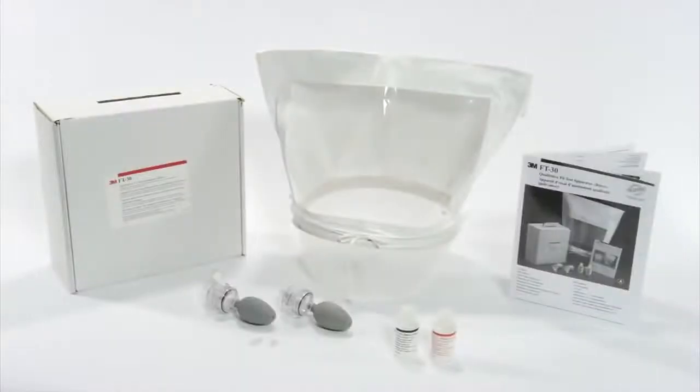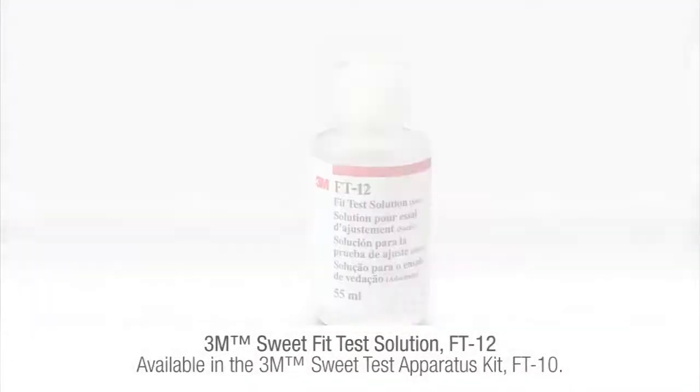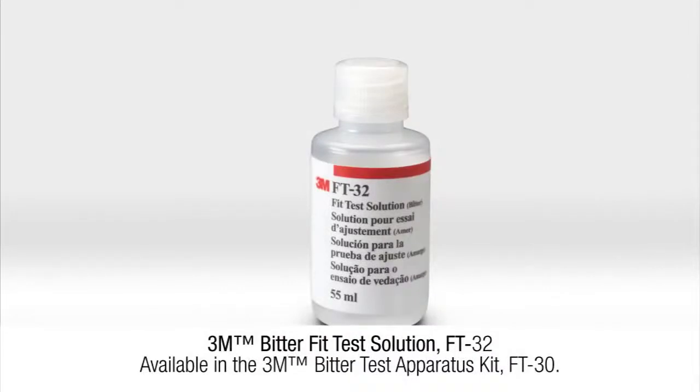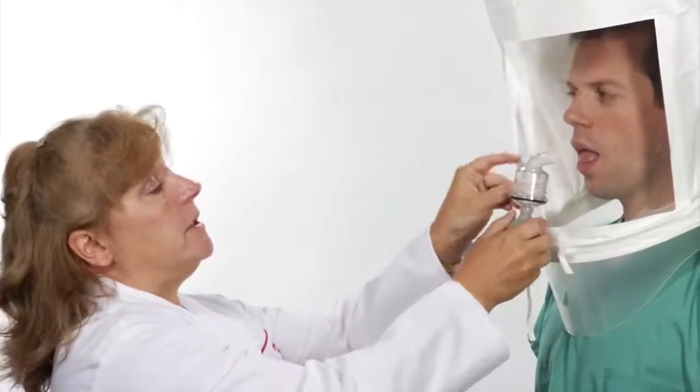There are two types of fit test solutions for qualitative fit testing available from 3M. A sweet solution as found in the 3M FT10 fit test kit and a bitter solution as found in the 3M FT30 fit test kit. Either of these solutions can be used, however, certain employees may be more sensitive to one solution over the other. During this training we will be using the sweet solution. The procedure is the same for the bitter solution.